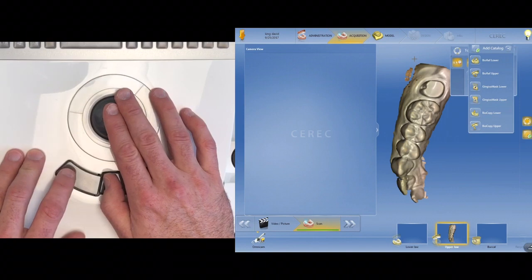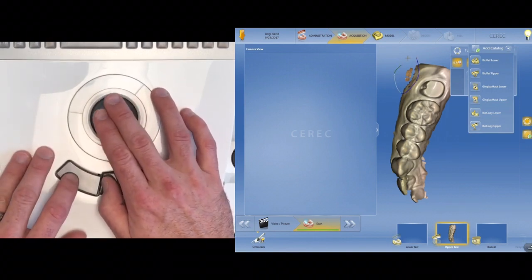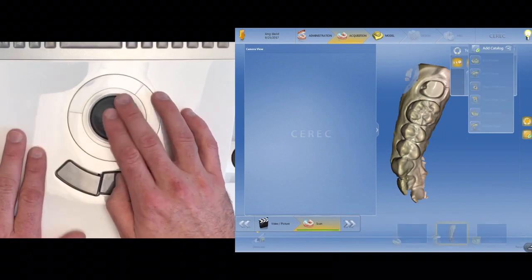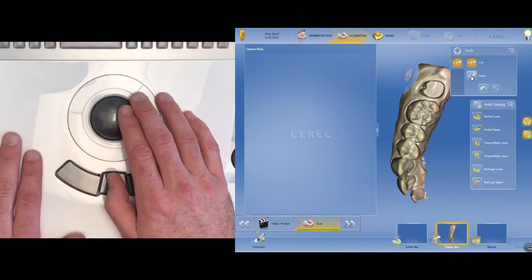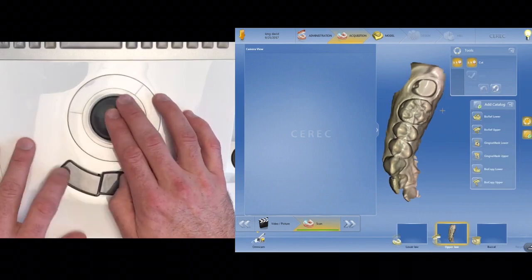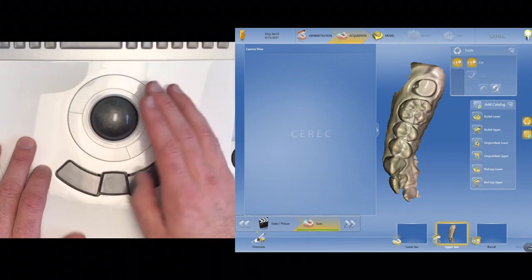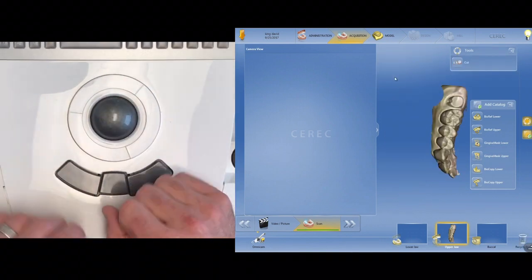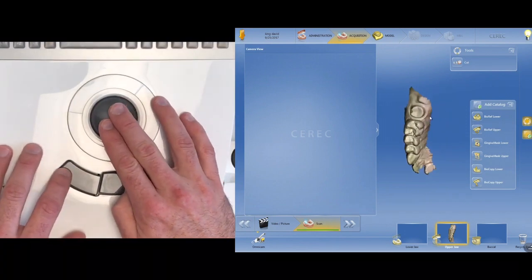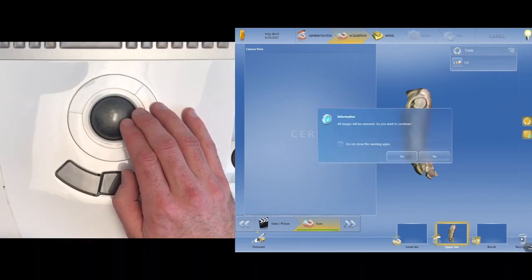To cut, just like with any other tool, you double click it to start. I'm going to select the area I want to cut out. Let's just say I wanted to get rid of that area. Once I'm happy with how it looks, then you have to hit apply. And I'm still in the cut tool. You can see the little hash right there. So I'm going to right click and select cut again. And now I have my pointer. All right, so let's go through the imaging one more time. I'm going to drag this over and delete it.